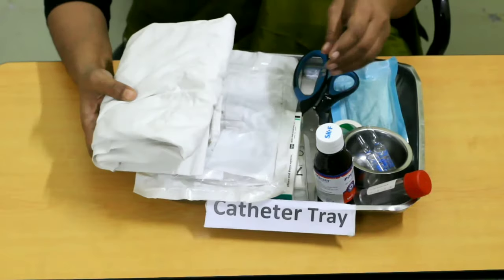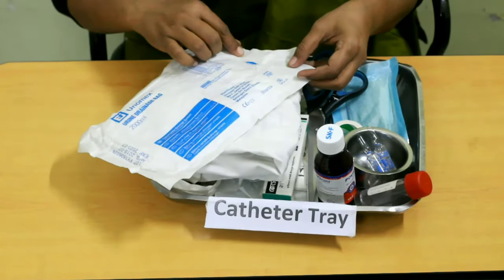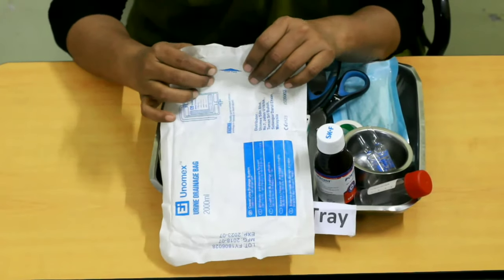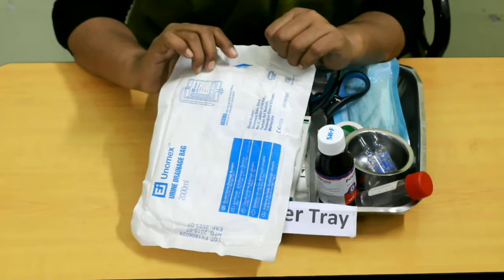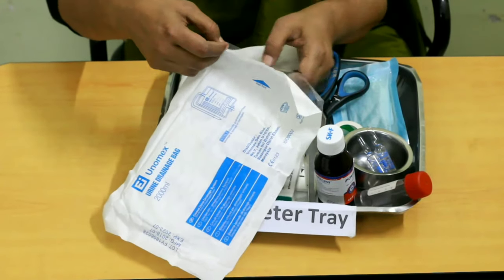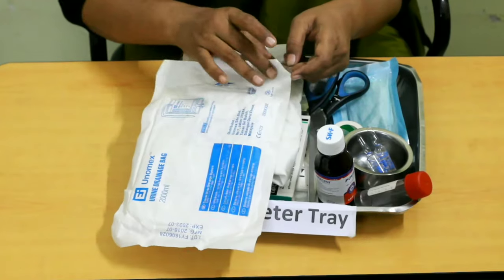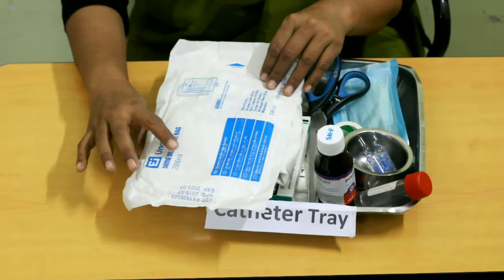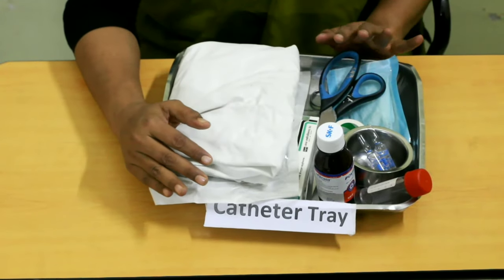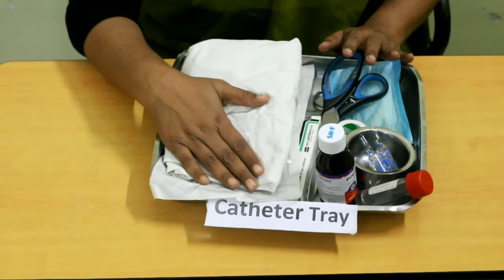We have to cut this packet and open it so you can see clearly. The packet will open. It is very clear — look at the left side. The skin should not be dry. It is very important that the skin is clean. The patient should have a clean draw sheet or a clean sheet. This is the case for catheter preparation.